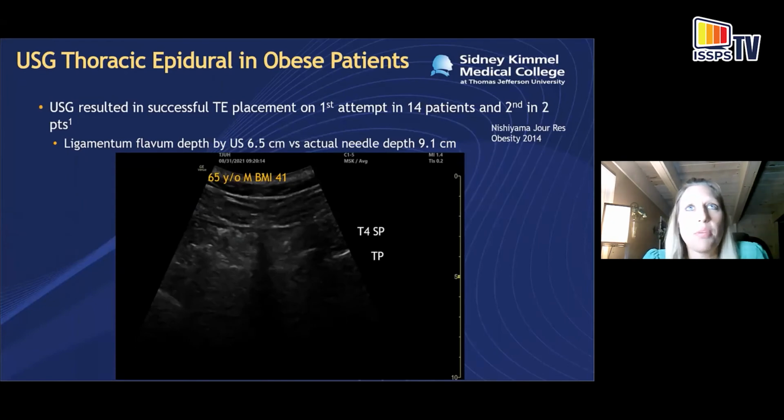And I'll touch a little bit on thoracic epidural. Thoracic ultrasound has been shown to be useful to assist in the placement of thoracic epidurals in obese patients, especially when landmarks are difficult to palpate. In general, midline is fairly easy to identify with the transverse view, because the thoracic spine is not as deep as you'd expect in the lumbar spine. I think the hardest area really is the lumbar area, because those structures are so much deeper. So in general, midline is easily identified, but visualization of the interspace in the paramedian sagittal oblique can be a lot more difficult, because of the thoracic spine anatomy.